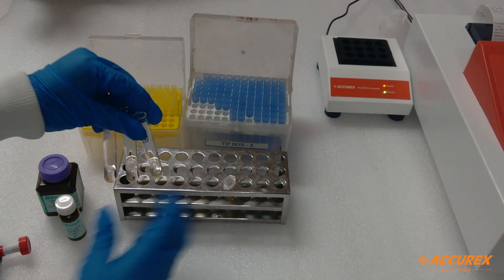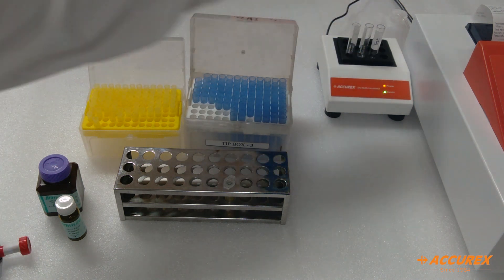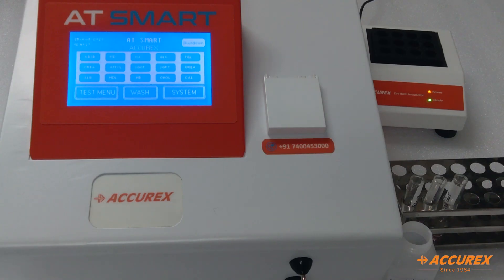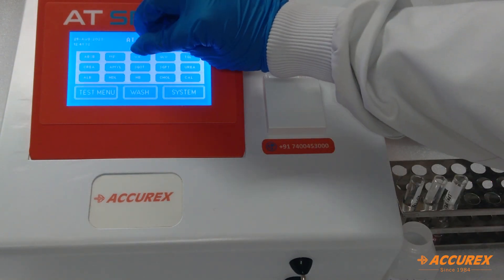Now we will put the samples for incubation for 5 minutes at 37 degrees Celsius. Then we will take readings — go to the main menu of the instrument and select the uric acid program.